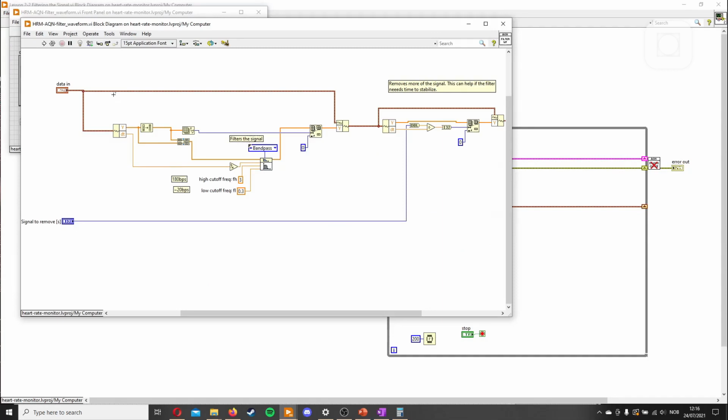So we can just add that here. Padded the reverse of the signal, and then remove the reverse of the signal. Sometimes this might be obvious, so this is a little bit bad commenting, so I'll just add another reason for it. Since the filter uses a few seconds to stabilize. There you go. Here you go.